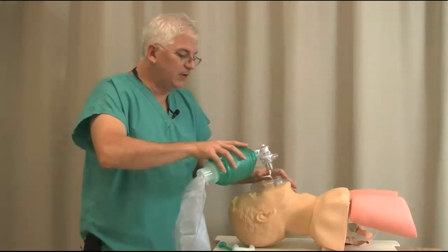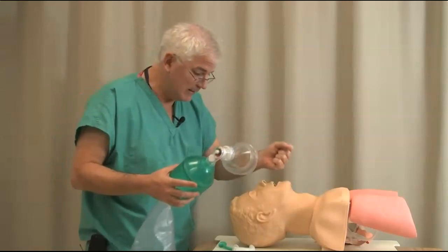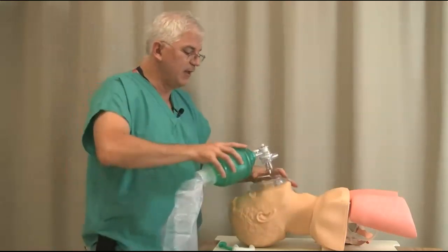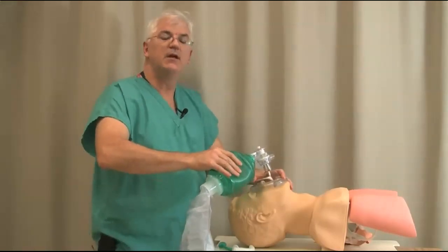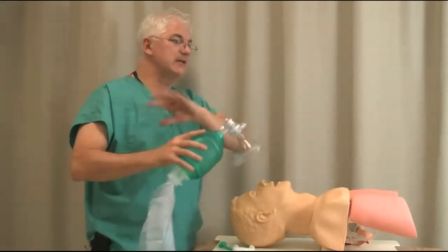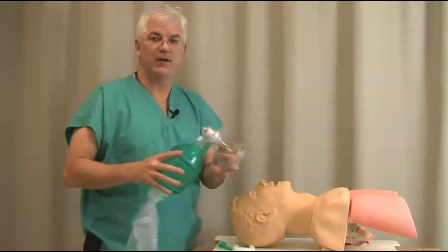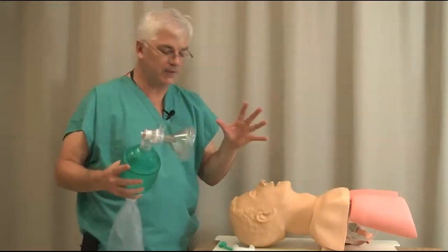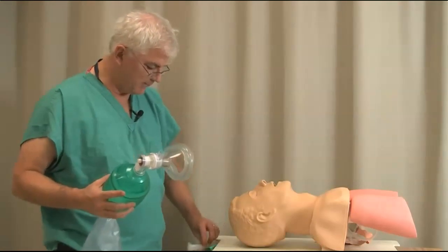Why is that? If you're trying to intubate someone and they're desaturating, going to hell in a handbasket, you're not going to be particularly relaxed. Whereas if you can mask someone up first and get their sat up into the 90s, you're going to be much more relaxed when it comes to intubating. So masking is something we need to think about, master and focus on when it comes to airway management. It's not something to be skipped or dismissed as just squeezing the bag. It really does matter.